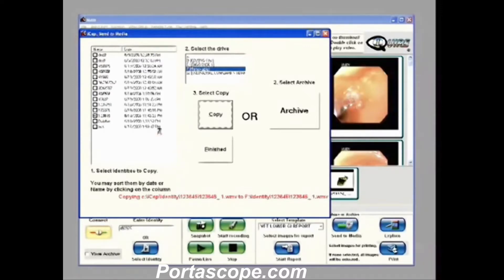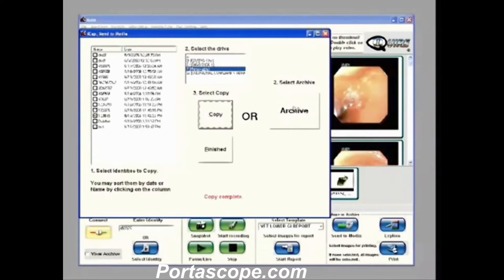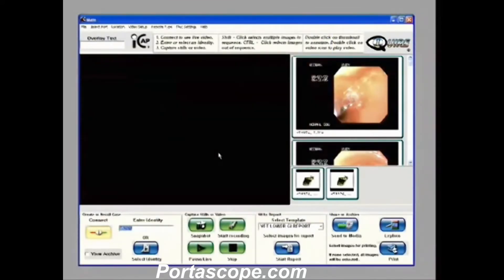Or if I like, I can archive. I can grab a bunch of cases, select the archive button, and that'll send them off to my archive location. The archive can be a local location — maybe another folder or file on the computer — or it can be a network location, maybe a server or a backup drive. Now that my videos and stills have been copied over to my flash drive, I have a copy complete message and I'll just hit finish to exit. It's that easy.